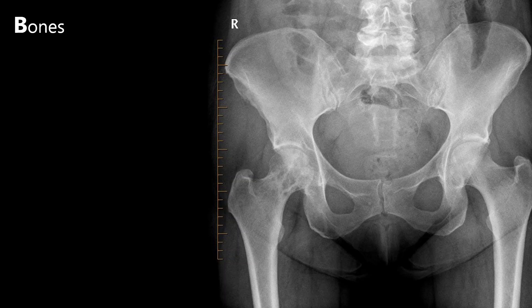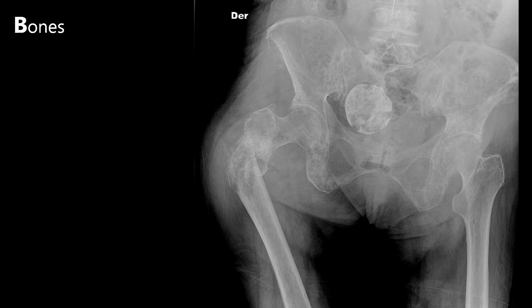As part of our bones assessment, we also need to check the bony texture. We can see in this patient there's a lytic lesion in the right femoral head. This is metastasis of a cancer into the bone. Common cancers that will metastasise to bone are prostate, kidney, lung and breast. This patient has a pathological fracture on the right femoral shaft as a result of bone metastases. Look at the texture of bone throughout the pelvis and right femur — there are lytic lesions and sclerosis. The large circular opacity is an incidental finding, probably representing a large uterine fibroid.